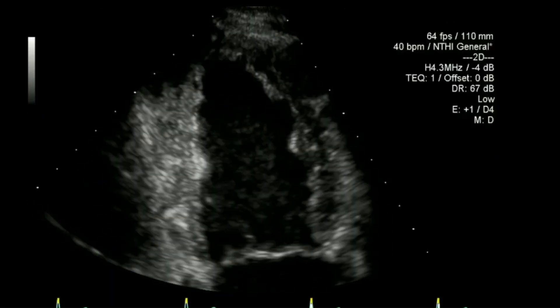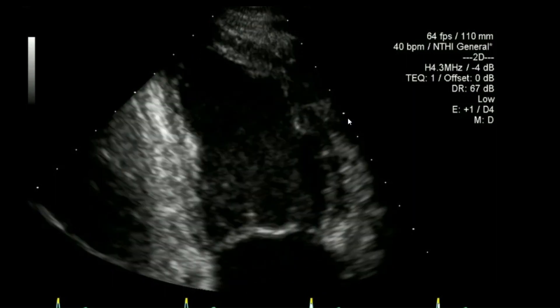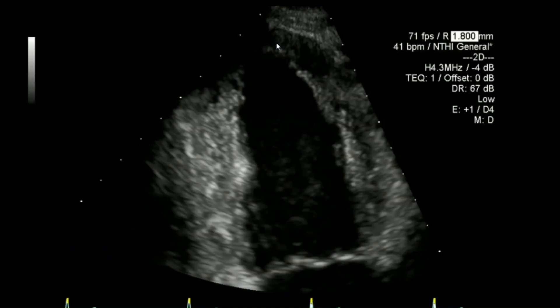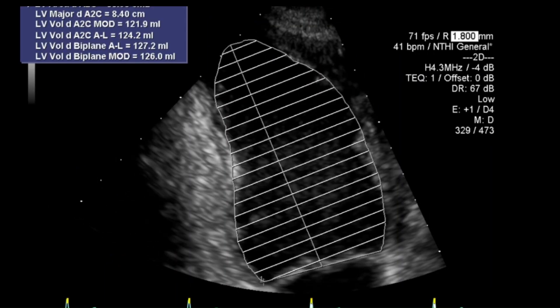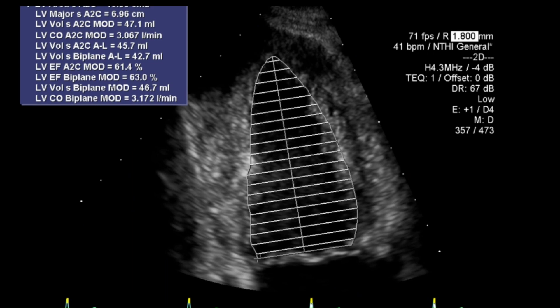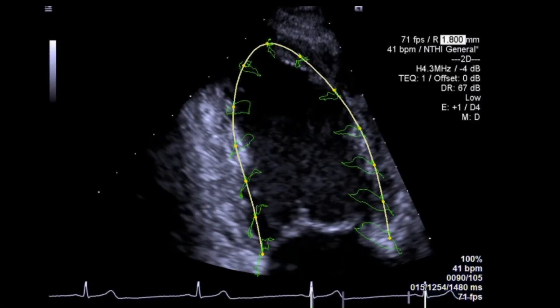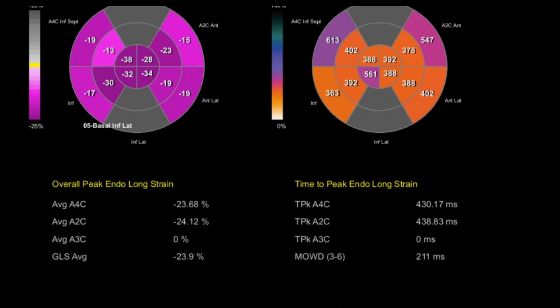Similarly I'll rotate to the two chamber view — grabbing the first view and also a second view where I've zoomed in a bit tighter. Then end diastolic and end systolic frames with a repeat of the global longitudinal strain — a similar number to the last view, raising the confidence of the measurement from the machine.